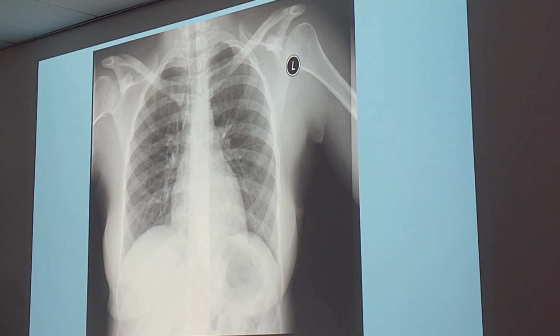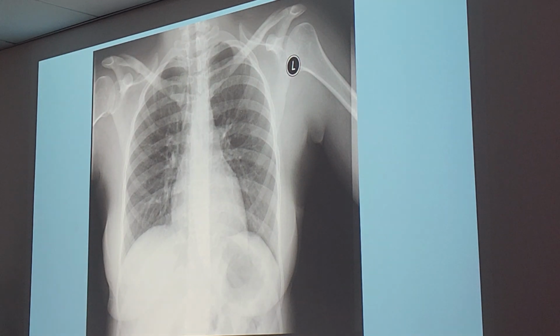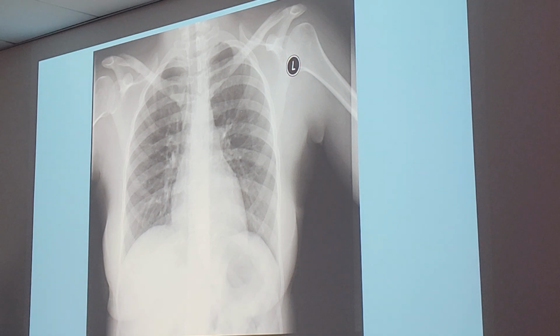Give me more than 2 for an unacceptable. Centering. Off-center? Yeah, it does look off-centered because there's more space on the left side than the other. Y'all see that? They didn't move the arms. Yeah, the scapula is not out of the way of the lungs. So this is definitely unacceptable. And I don't think they see the SC joint. On this one, it's a little bit more open than the other one, so they're not equidistant. There's some rotation going on also.